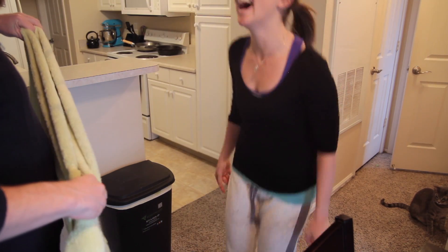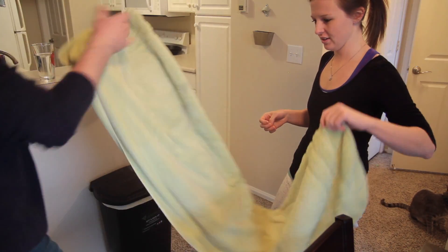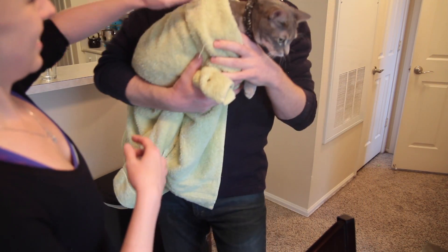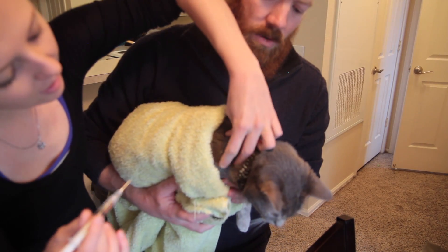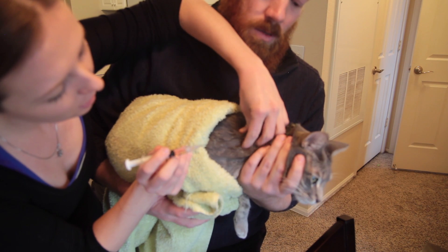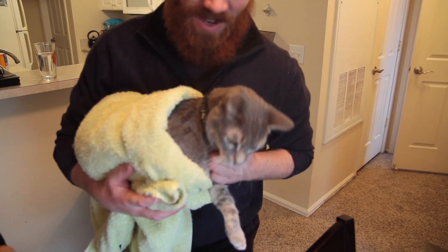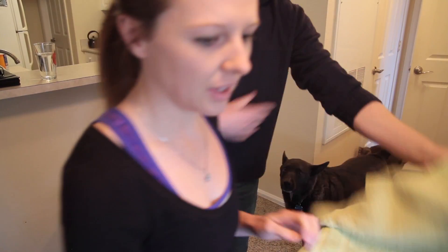He's eyeballing the heck out of me right now. Act casual. We're going to have to do his quickly because I'm scared. He does have one claw out, so watch that. Going behind the neck, not on the spine. Pulling his skin up. Here we go. It was kind of harder to find his skin than the dog's — it was deeper than I expected. But it got in there. He's good.